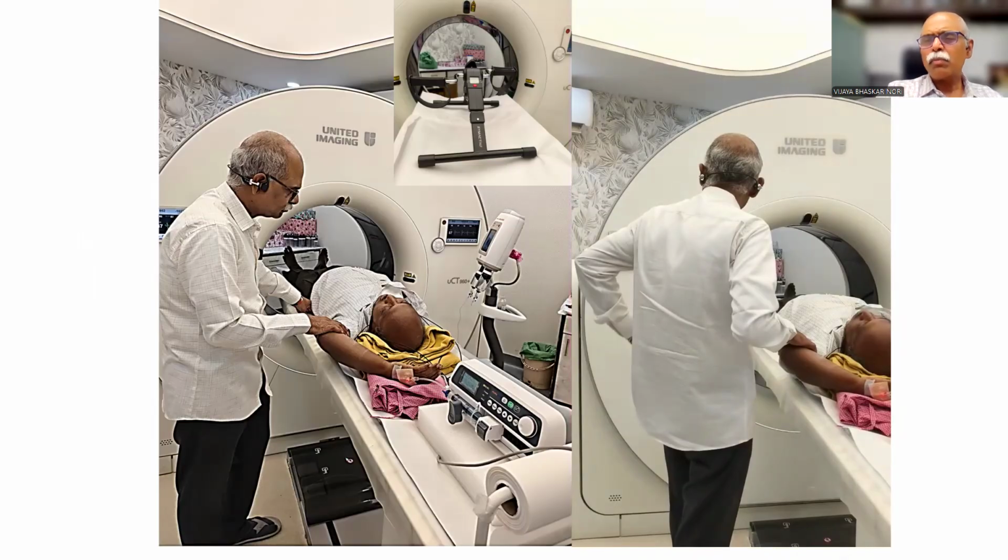Number two, the patient's concentration will be more on doing the procedure, doing the limb elevation, and he will try to overcome the somatic complications like flushing, chest pain and chest discomfort. Those are relatively ignored by the patient. So, by doing this limb movement, number one, bradycardia and hypotension in the supine position can be averted. Number two, increased blood flow to the heart can be maintained. Number three, more patient reassurance, and the patient will try to ignore the somatic complications of the adenosine, and will give better compliance.